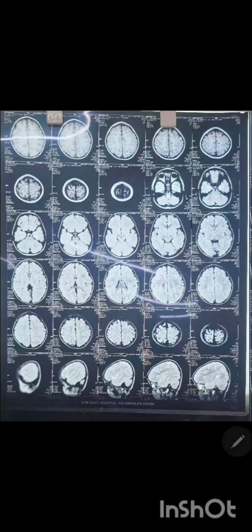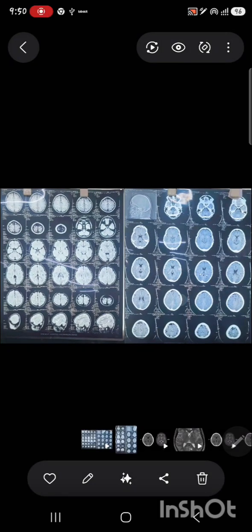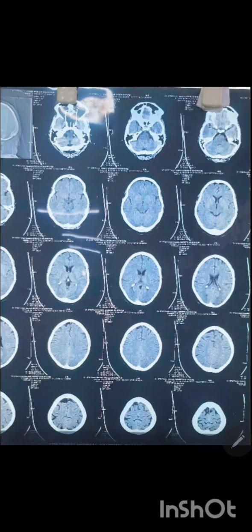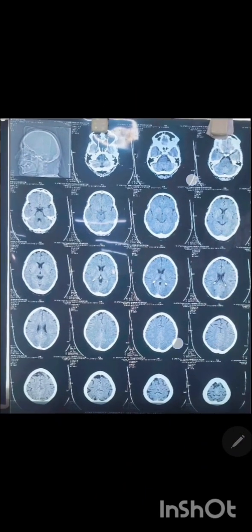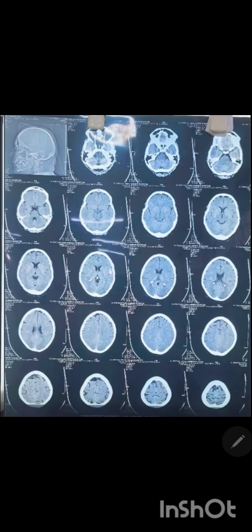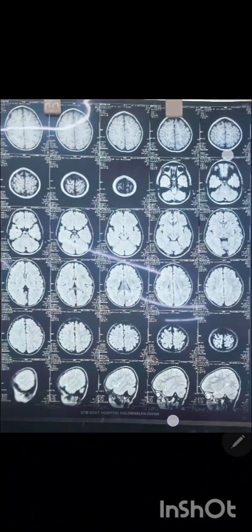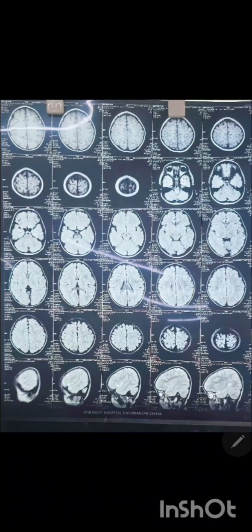On the basis of radiation, in computed tomography, yes, radiation is present during the CT scanning process, but during the MRI process, the radiation is almost nil.